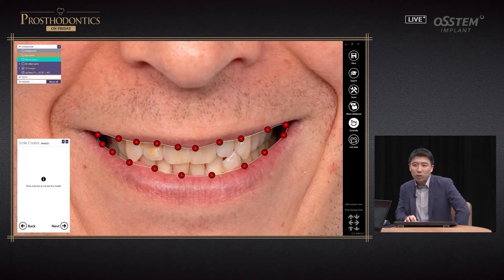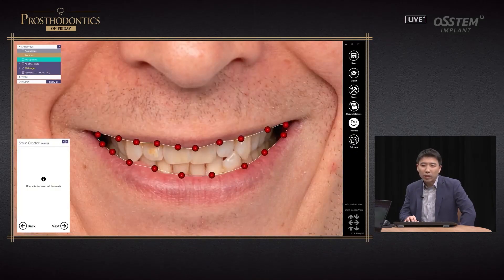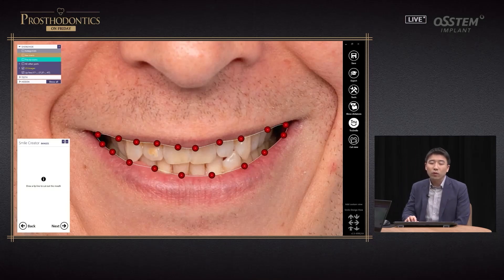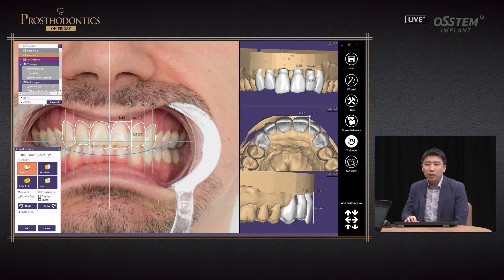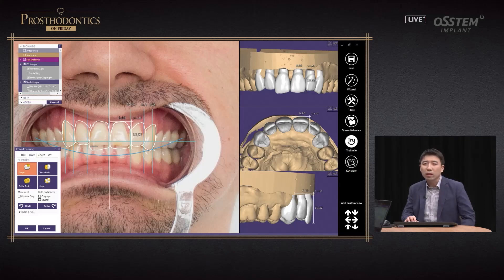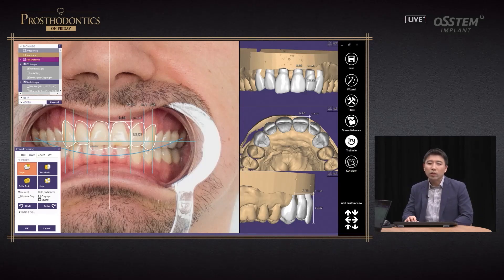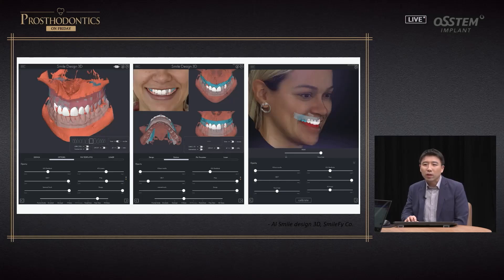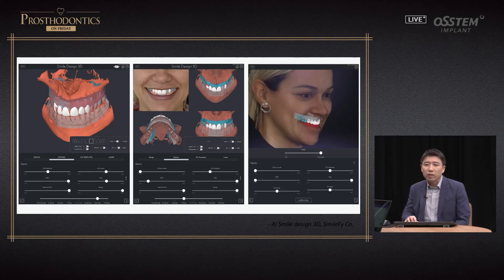Using a natural smile image, you can cut out the lip and evaluate how the prosthesis will look. The downside is that because this is a hybrid of 2D and 3D, you cannot really see how the prosthesis looks from the side or assess the occlusal plane, and it is difficult to evaluate dynamic occlusion. However, in smile design software with 3D solutions, you can look at lateral views or bottom views, allowing evaluation from multiple angles.